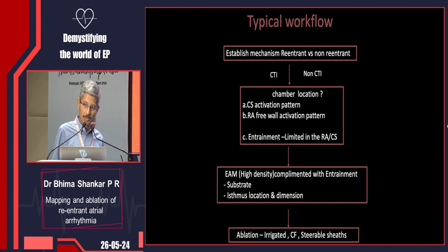There could be a small difference in school of thought. Some of the operators think that entraining would actually terminate the tachycardia or alter the tachycardia to some other flutter, but a limited entrainment would actually help focus our 3D mapping to the chamber that is of interest. And then once you find out the chamber of interest, you take up your 3D mapping system.